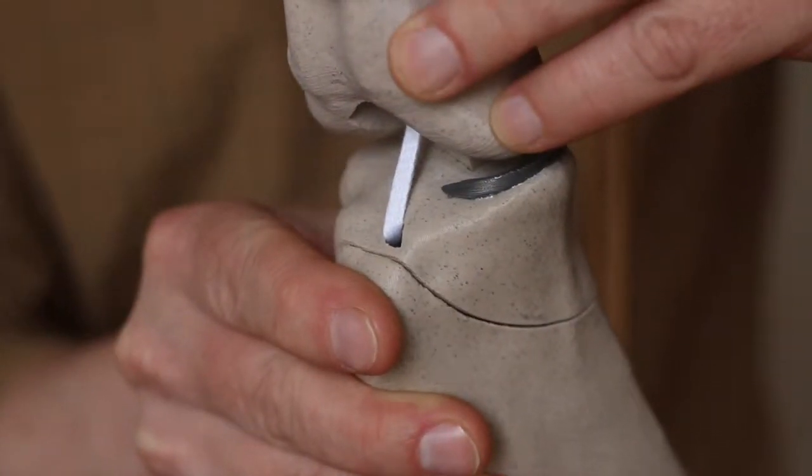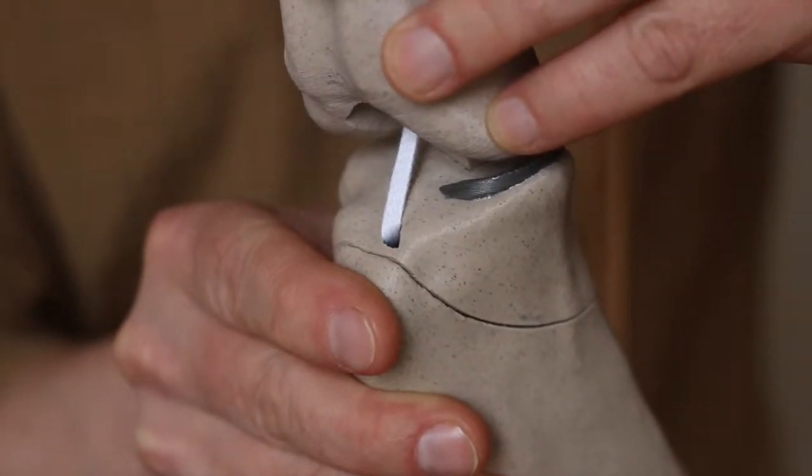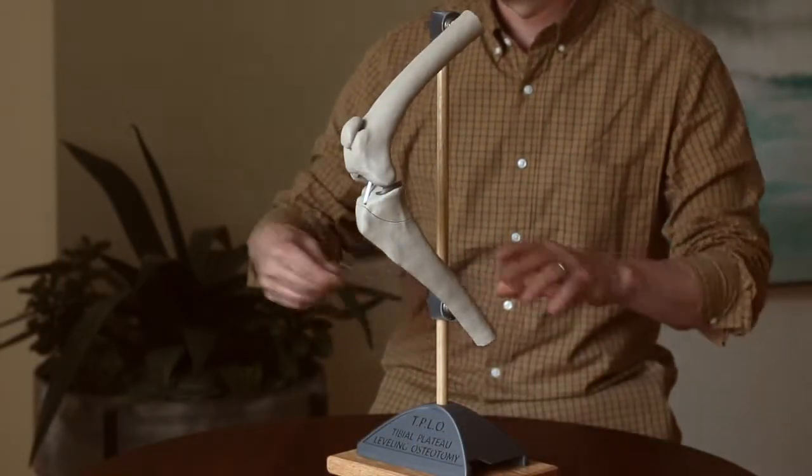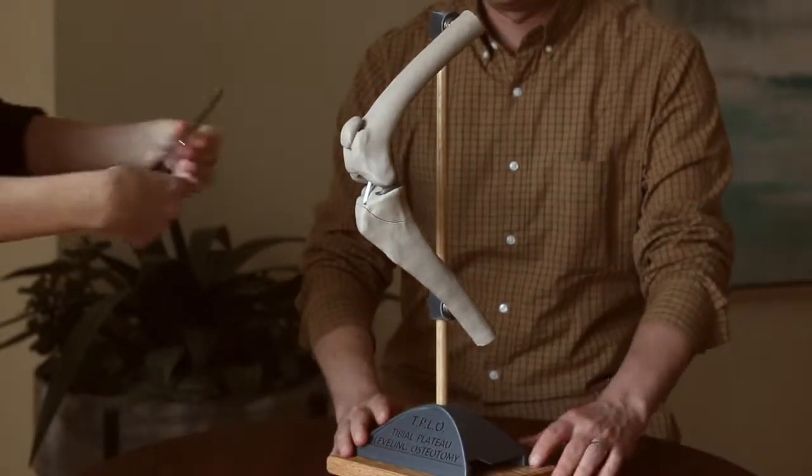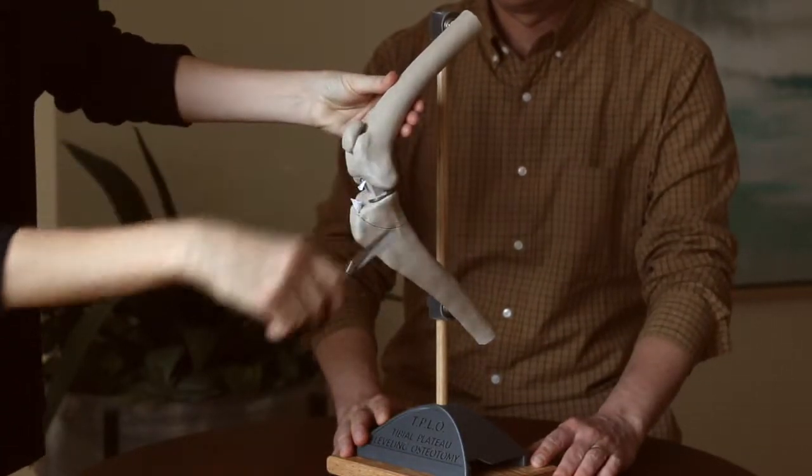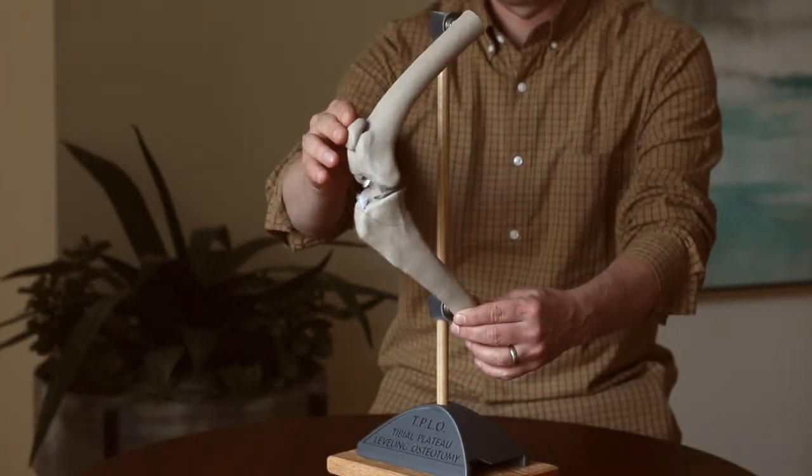We can simulate tearing of the ligament by cutting it, and you can see when that ligament is cut, immediately you begin to get this shifting in a front-to-back direction. In people and in dogs as well, this is called drawer motion, like a drawer going in and out.